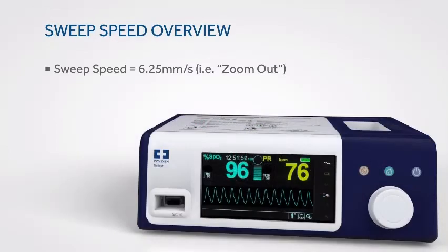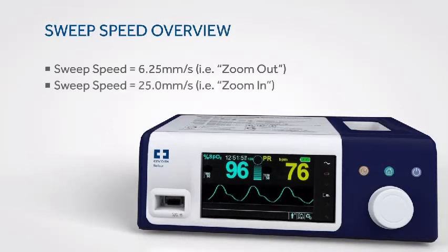The sweep speed view allows you to set the speed at which the SpO2 waveform trace moves across the screen. The higher the sweep speed value, the more granular the data that appears on the screen.